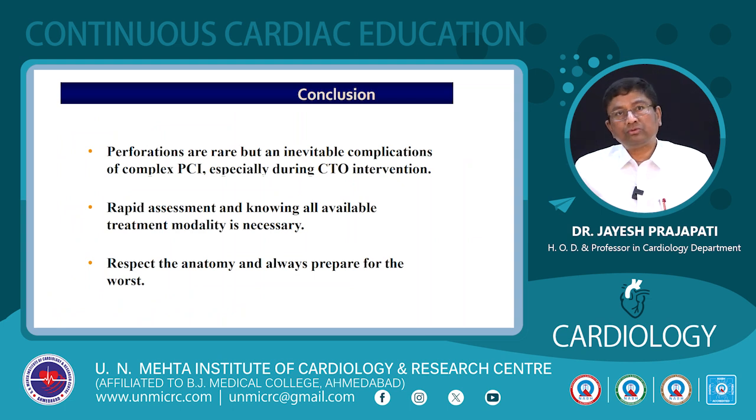So to summarize, to conclude today's discussion, perforation is rare but it's inevitable. It can occur at any time in complex PCI, especially during CTO interventions. Rapid assessment and knowing all available treatment modalities is necessary. Early recognition is important. Late recognition, sometimes in the middle of the night at 4 a.m., comes with an ICU call that the patient has arrested. You know there is a tamponade, and you have no time.